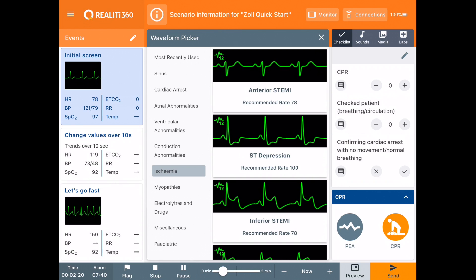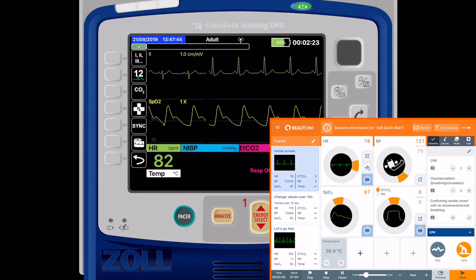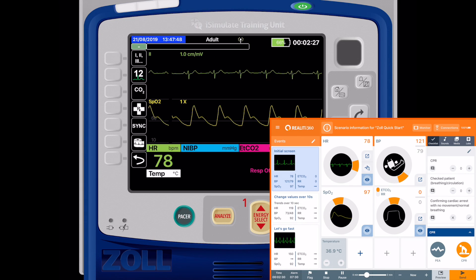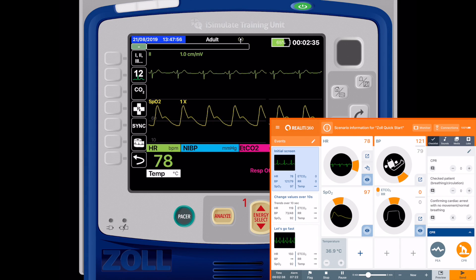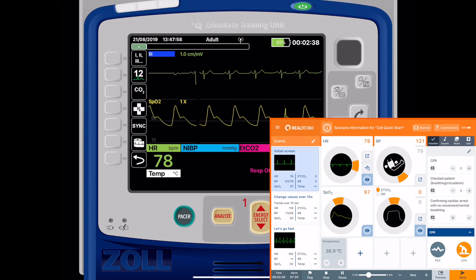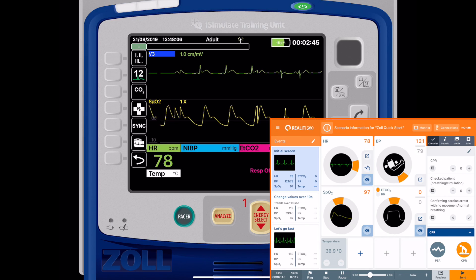Let's just pick the anterior STEMI and tap on send. Now we can see that the ECG changes to a lead 2 on the Zoll X series. On the Zoll X series you can change the lead that you see, so by just tapping on the soft key up here I can go through the leads — there's lead 3, AVR, AVL, and so on. We can go through each of the leads.